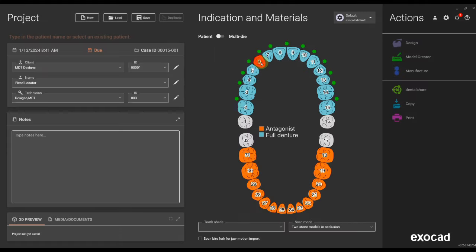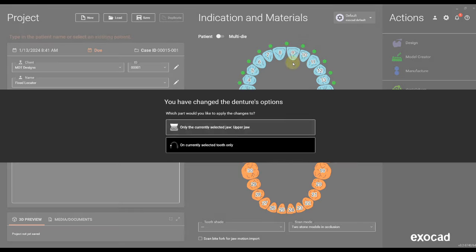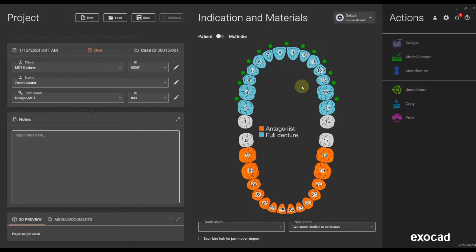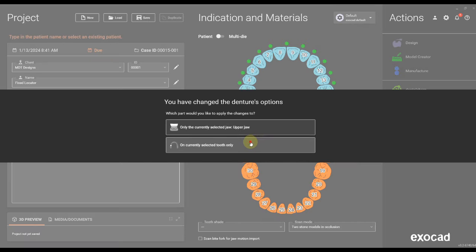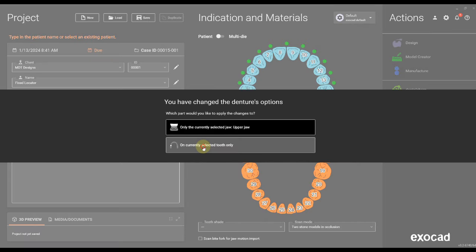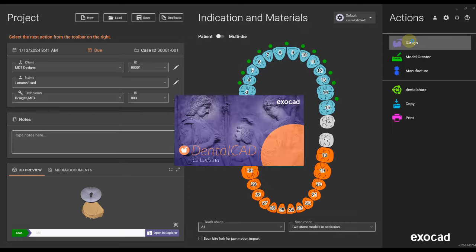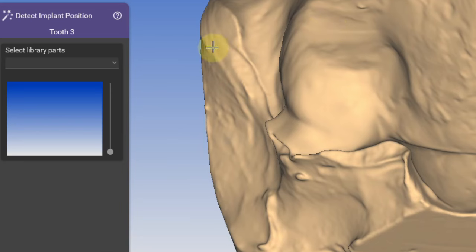For the other locator sites, click on the teeth to assign locators while holding the control on the keyboard. I wish Exocad 3.2 would highlight these selected teeth in a different color for better visualization.